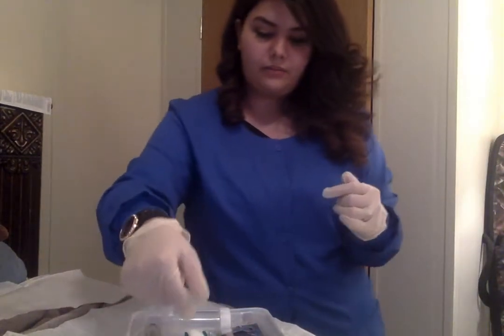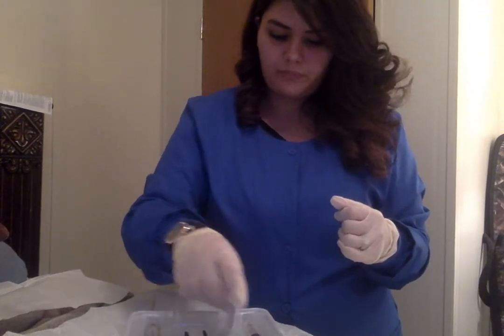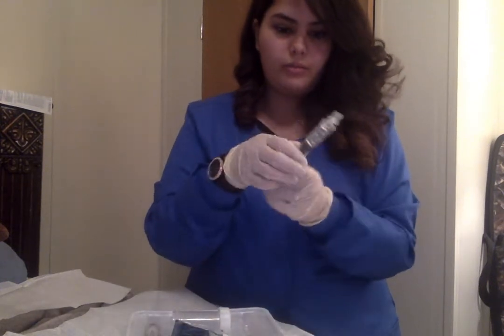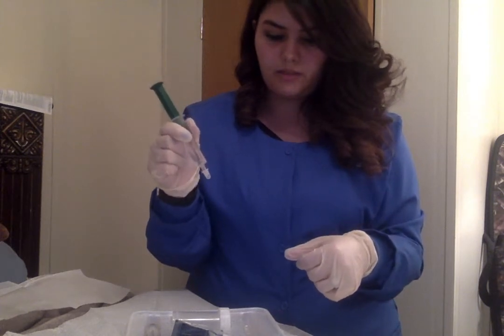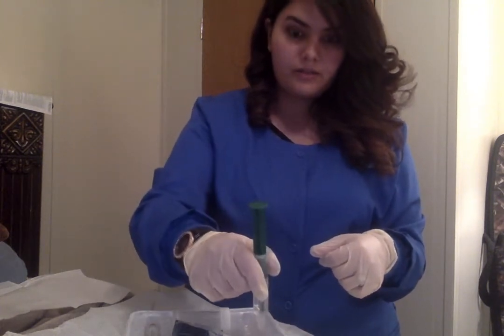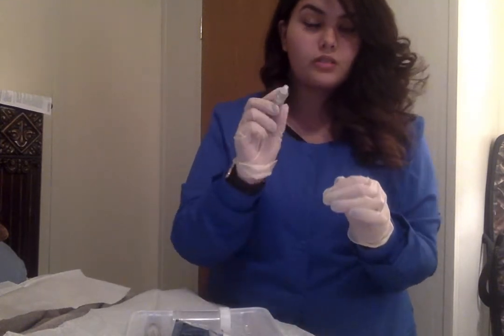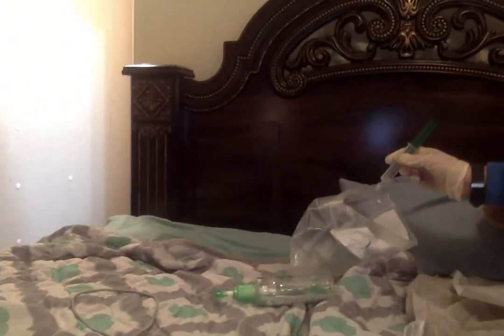Okay, now we're going to get our lube. Which one's the lube? I think this one's the lube. And we're going to squeeze it in here. Squeeze. And then we're going to throw this away without contaminating our gloves into the sterile bag.